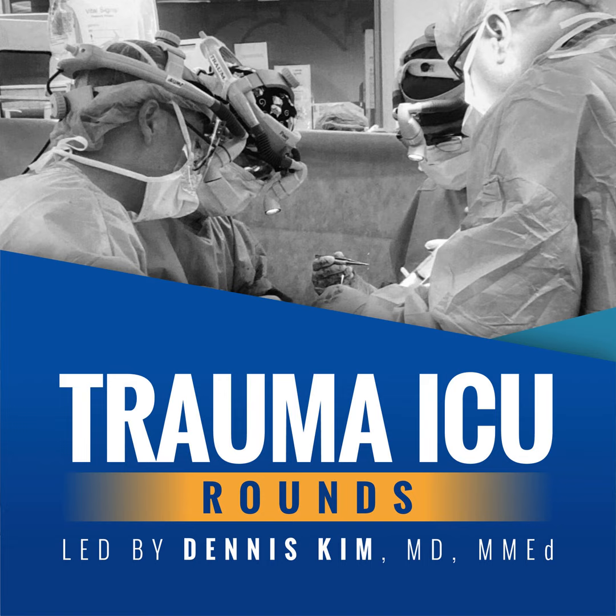For example, if a patient is in the OR undergoing major abdominal surgery, these patients will be heavily sedated, analgesed, I know that's not a word, and paralyzed. Therefore, every breath the patient receives is by definition a mandatory breath. Controlled mandatory ventilation, or CMV, is an example of a ventilator mode in which all breaths are considered mandatory breaths.